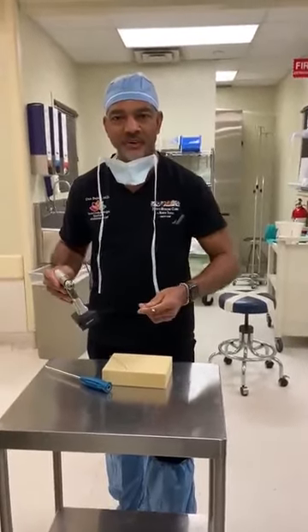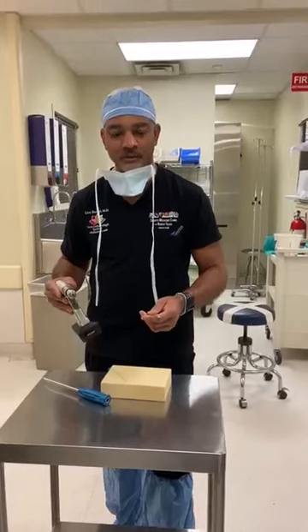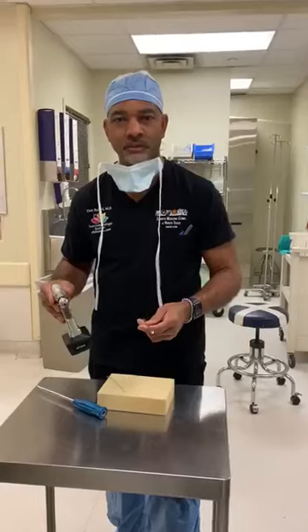Hi guys, Dr. Buford here. You know I like toys and we've got a new toy to play with here in the operating room that we're about to demo for the first time. I think I'll be one of the first to use this.